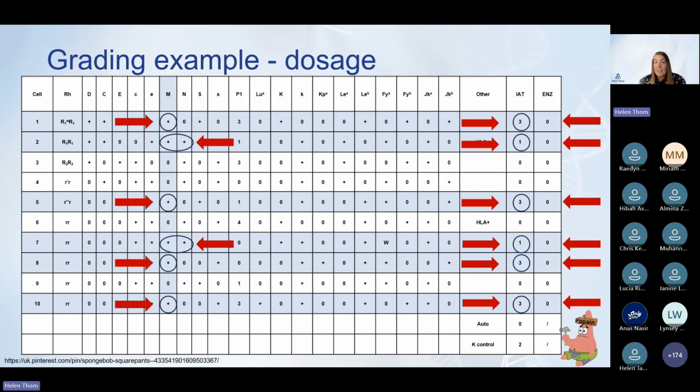And anti-M is sensitive to papain. So when you're confirming the presence of an anti-M, it's good to know that it can react by IAT. It's sensitive to papain, so it disappears in your enzymes. And it may even be that it's not hitting the heterozygous lines.